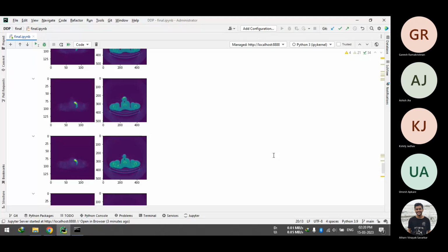Is that what you're saying? No, we may do that, but only to identify our normal organ, because we wanted to identify normal organs as well. So if we want to identify the normal organ, I think a better option is that first you divide the body into various parts, then identify the particular organ in that part.